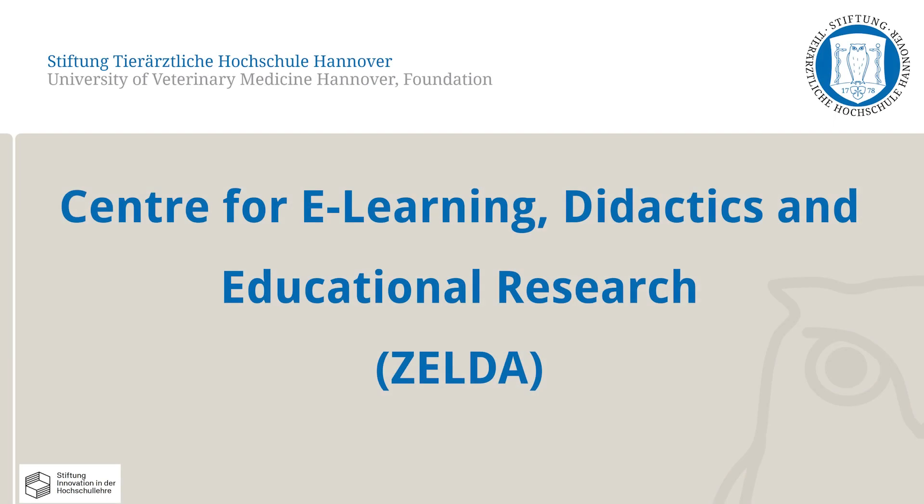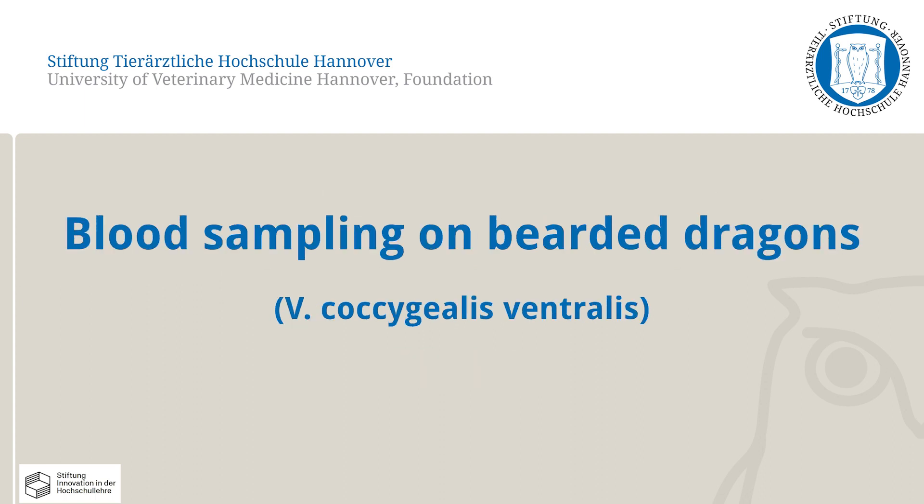In this video, the Center for E-Learning Didactics and Educational Research at the University of Veterinary Medicine Hanover will present how to draw blood samples from bearded dragons.